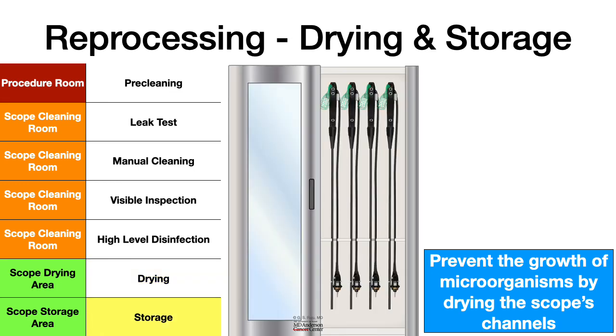And following that, you store them vertically, as you can see here. And some of these storage areas can have a special mechanism to continuously blow air, and this prevents the growth of microorganisms by keeping the channels dry.